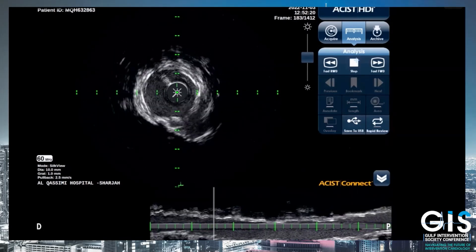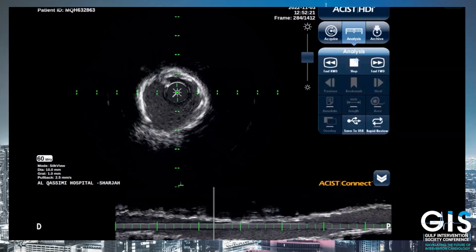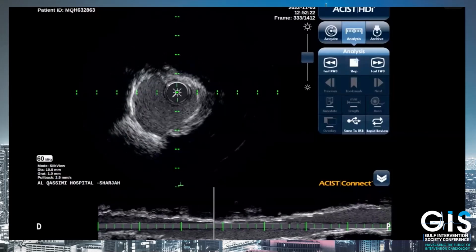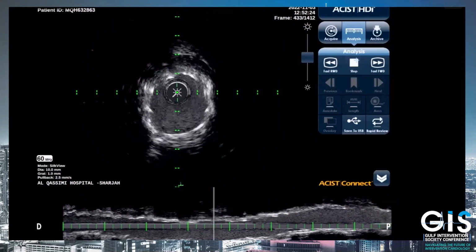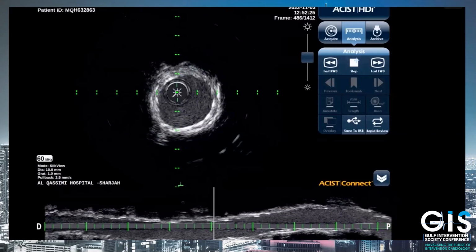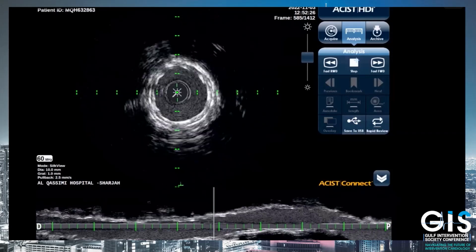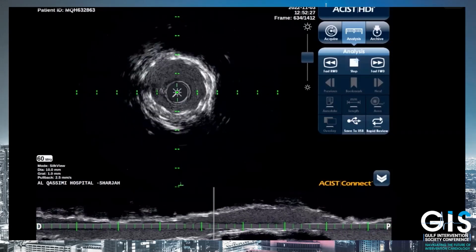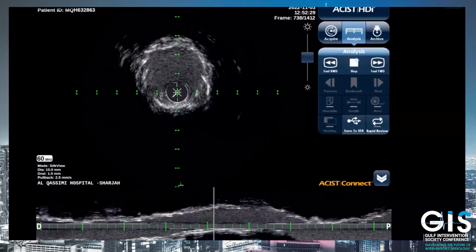But for the timing, the patient underwent a really complex situation before we went live. And he is on renal guard, he is on IVAC, a lot of things. So I don't think doing anything, landing in more complications for this patient unnecessarily at this stage. We would consider that circ later on, but re-accessing that, I don't think will be a big and major issue. Let's have one angio cranial, please.